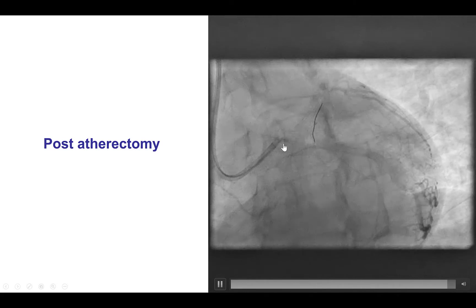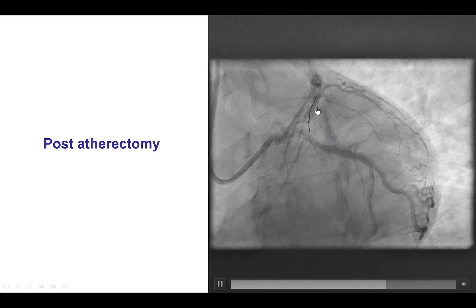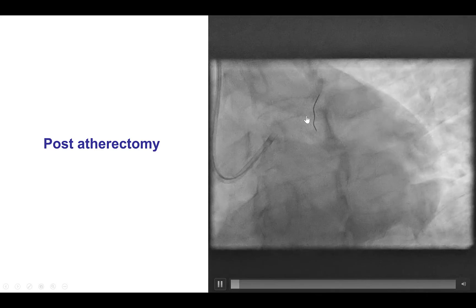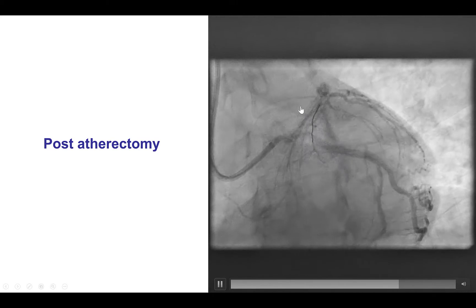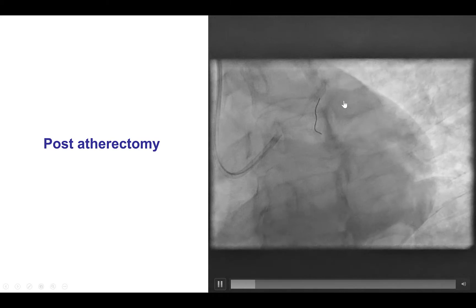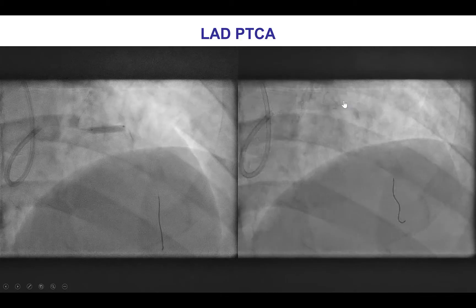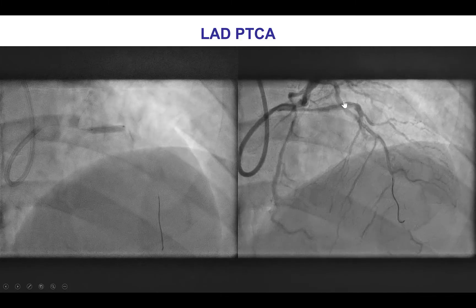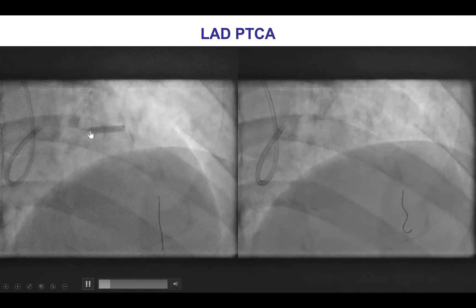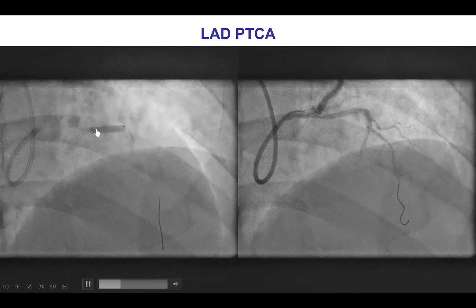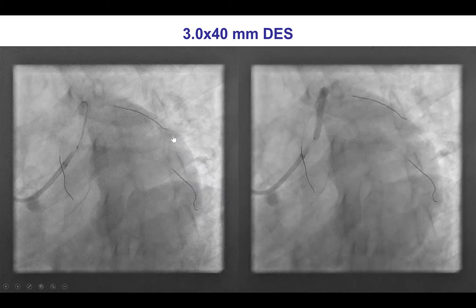That lesion significantly improved. We did not have a wire in the diagonal during atherectomy to minimize the risk of wire fracture. We then achieved good balloon expansion of the LAD after atherectomy was performed.